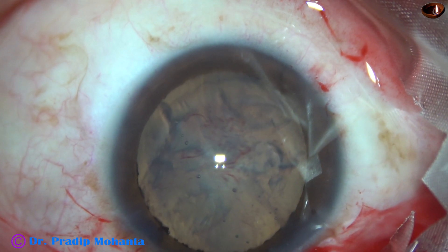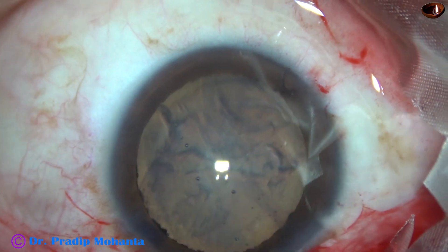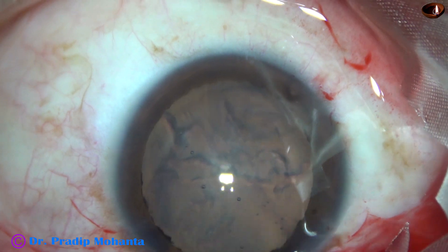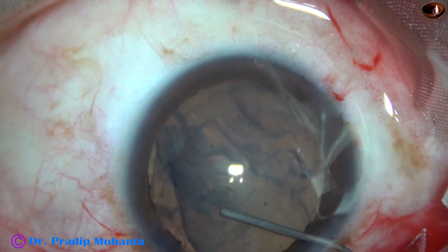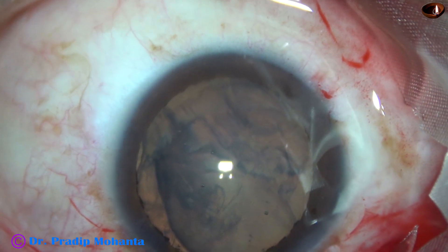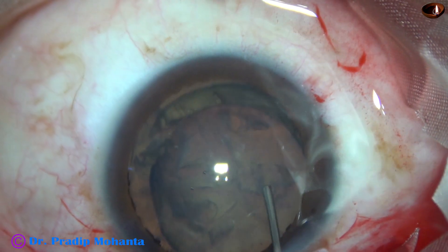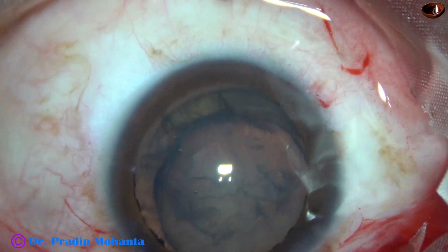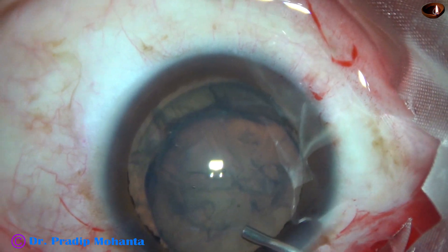There is no nucleus basically — the patient is a 22-year-old man, and you can just aspirate the lens matter. The whole thing has got separated from the posterior capsule.